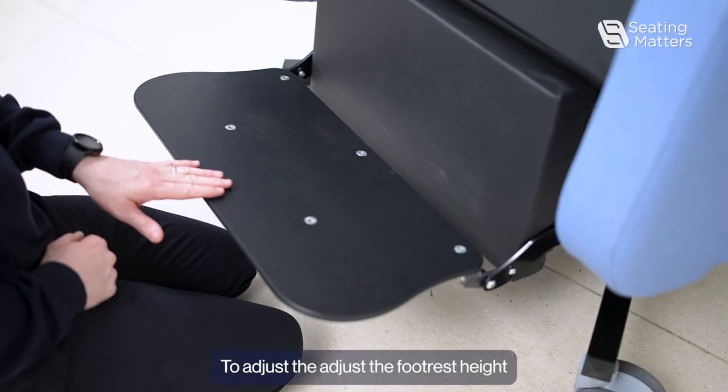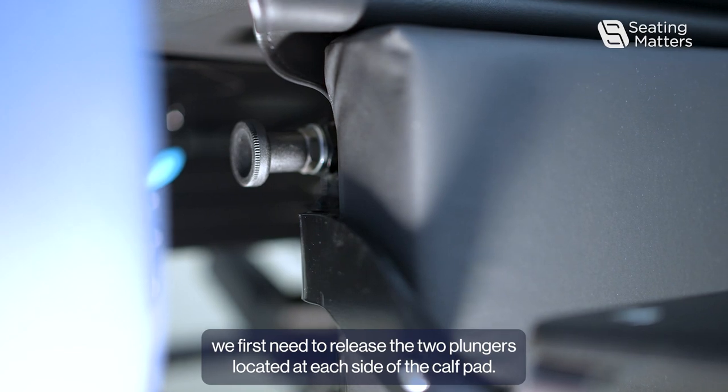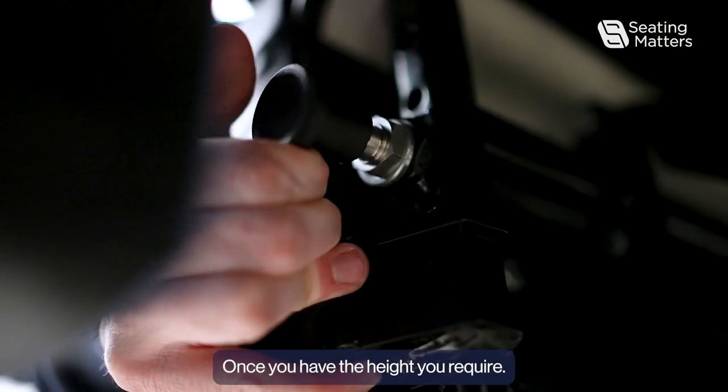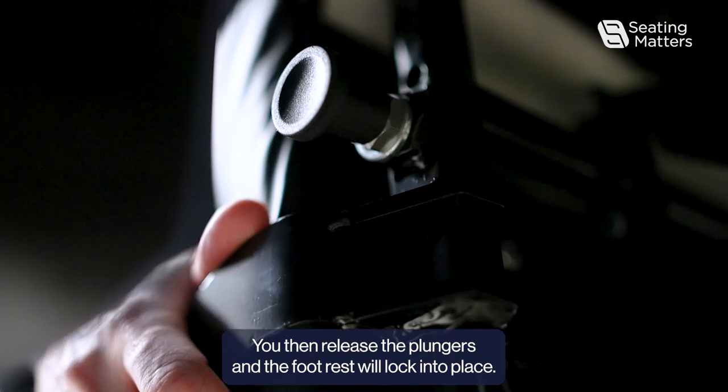To adjust the footrest height, we first need to release the two plungers located at each side of the calf pad. That will allow us to move the footrest up and down. Once you have the height you require, you then release the plungers and the footrest will lock into place.